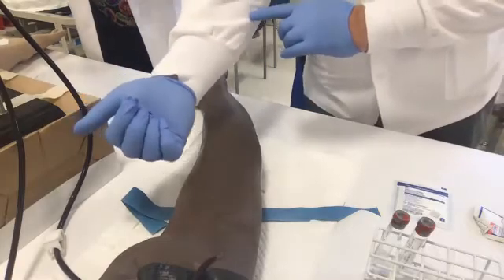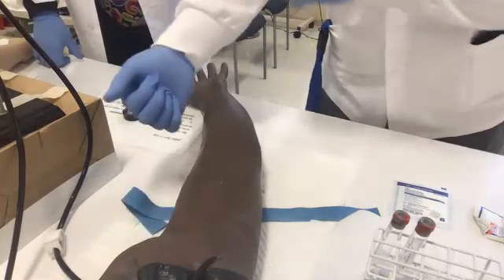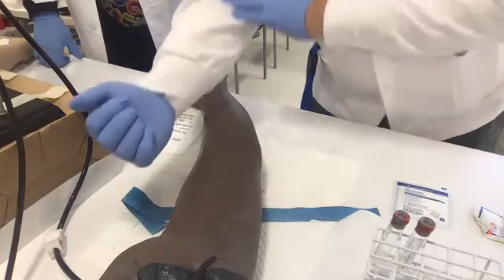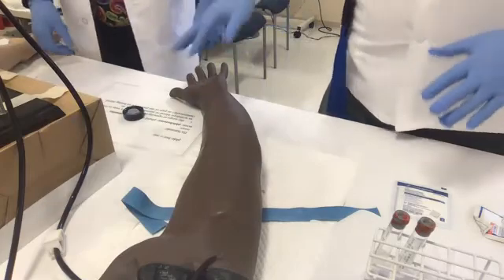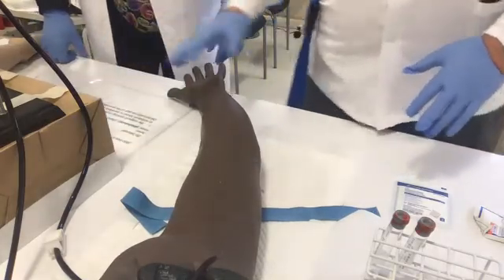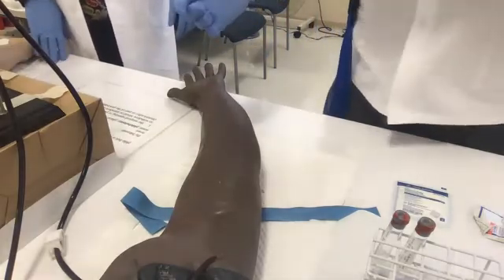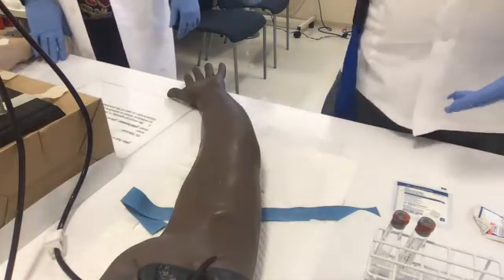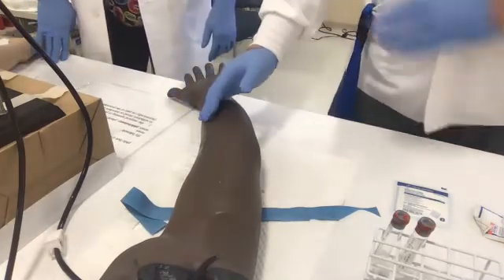There are also accessory veins that can be hit a little further down, but your primary objective is here, in this little depression called your antecubital fossa. Know these things because they're on exams, and also, when you're talking to another professional, you don't say, "Oh, I'm gonna hit them right in the bumpy." You want to sound like the pro. So antecubital fossa, I know what vein I'm hitting.